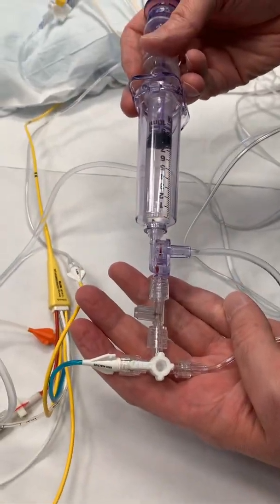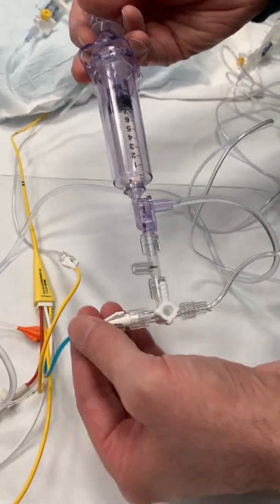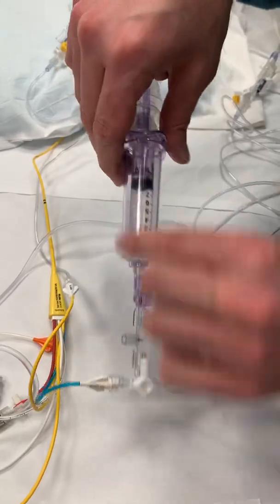To get your CVP tracing, you need to have your stopcock open so that it's going toward the transducer. So now we're off toward the cardiac output. There's one more piece we need, which is the cord.